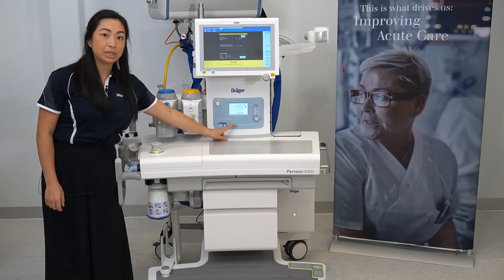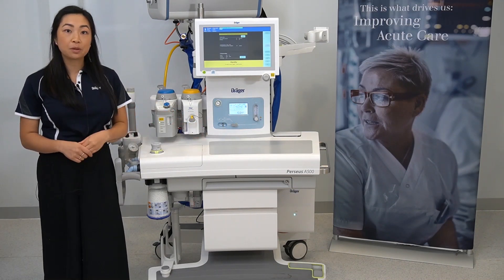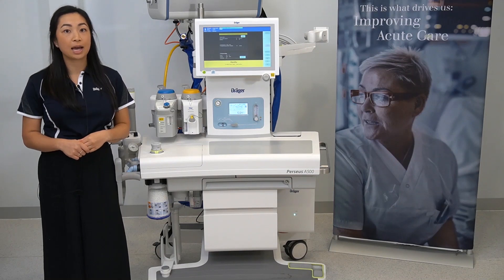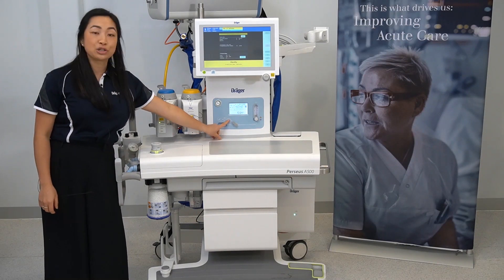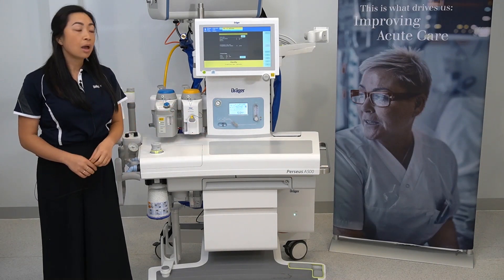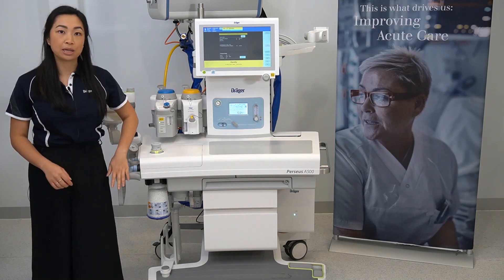When the oxygen switch is set to auxiliary oxygen, you can deliver supplementary oxygen to the patient via Hudson mask or nasal prongs. When the oxygen switch is set to add O2, the oxygen will flow through the back bar and into your breathing circle circuit.